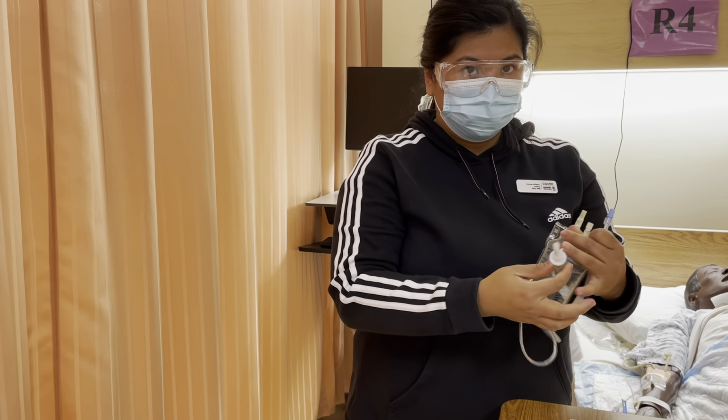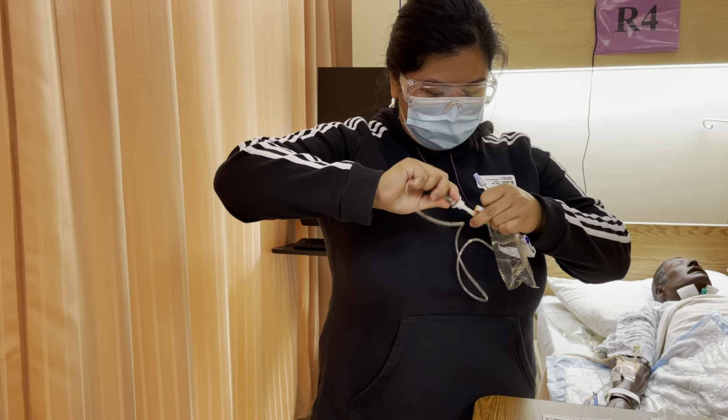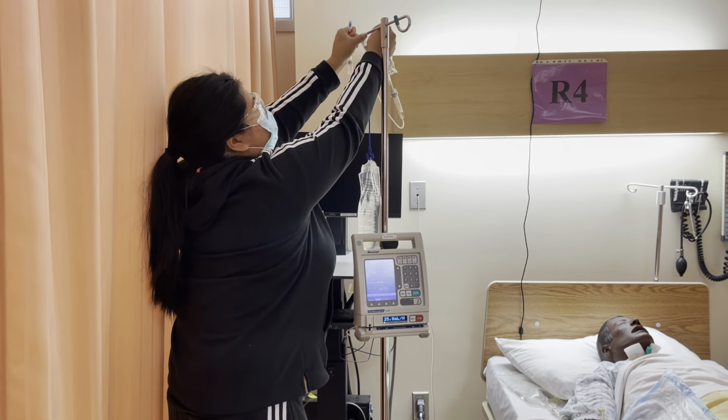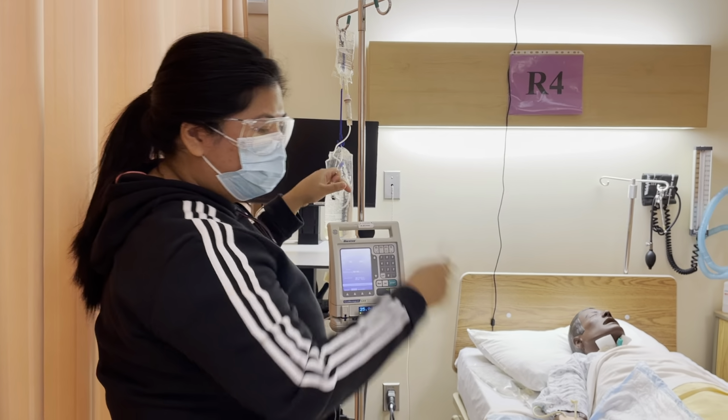The right drug we're giving today is... we'll spike our bag, and we can see we have ampicillin and ampicillin. The dose we're giving today is 750 milligrams, 750 milligrams. The route we're giving is IV. We have an IV mini bag for an intermittent infusion. And then we'll swab our port.